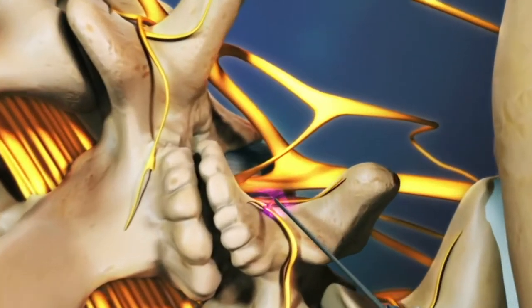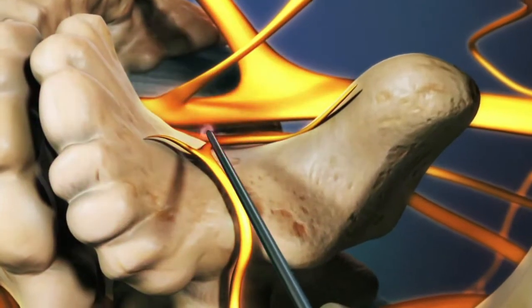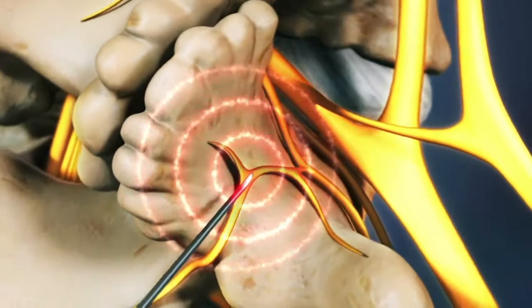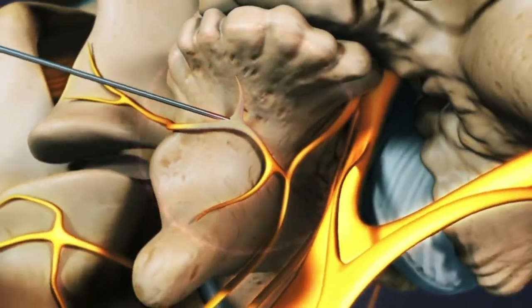The targeted nerves will then be numbed with a local anesthetic to minimize pain. The radiofrequency waves are introduced to heat the tip of the needle, and a heat lesion is created on the nerve to disrupt the nerve's ability to send pain signals to the brain.